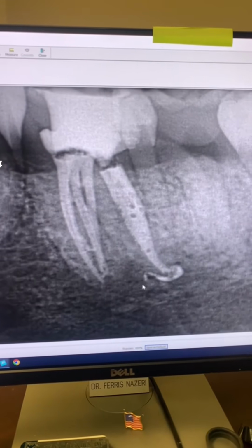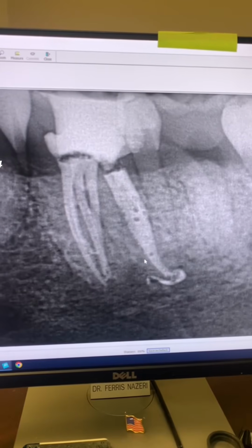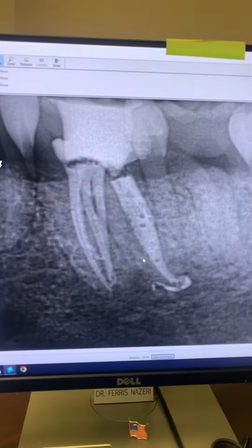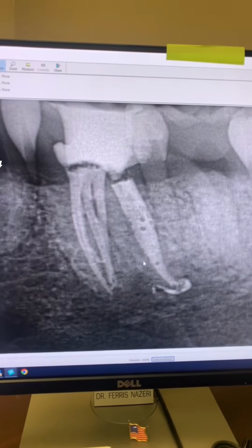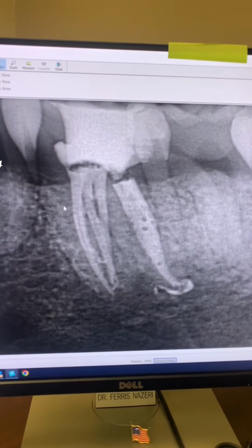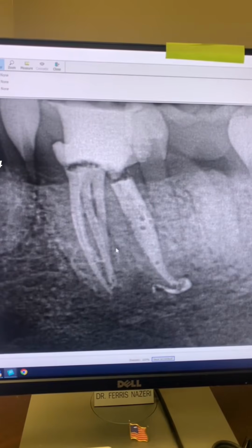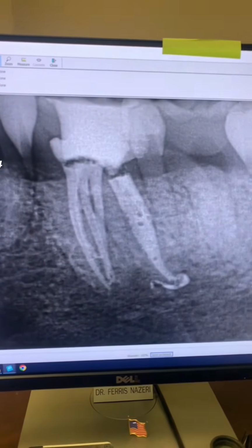We did this, of course, in one appointment, despite the fact that there was a buccal parulis and sinus tract associated with the tooth. The canals were dry before obturation. We checked that with a sterile paper point taken to working length. Everything worked out beautifully, as you can see. 6% sodium hypochlorite, sonic and ultrasonic activation, and then warm vertical obturation with AH Plus sealer. We temporize the tooth and refer the patient back to our dentist.